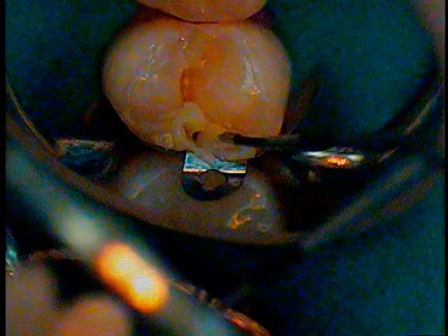Now I'm going to build the base and layers, and I might even use a perio probe to condense something even smaller. I use my gold instrument to condense. I haven't touched the occlusal where there's a huge documentation on C factor on the occlusal. So now I'm going to go in vertically, just slowly going in with increments. Pushing it in place. Condensing properly.